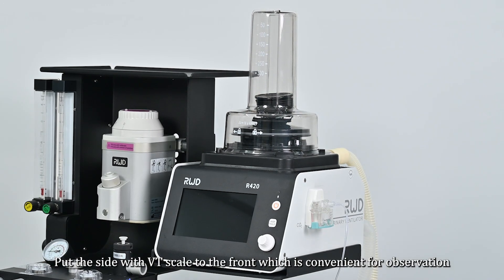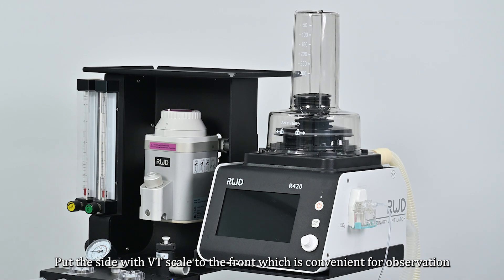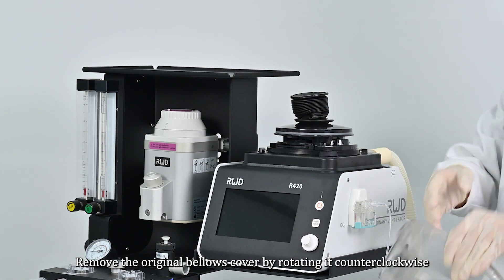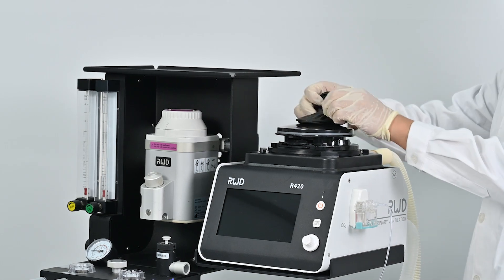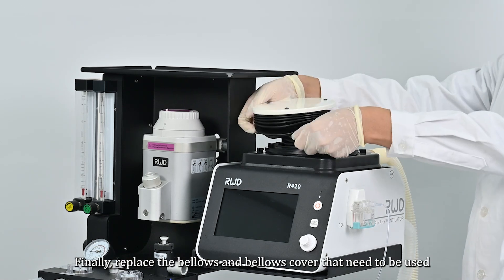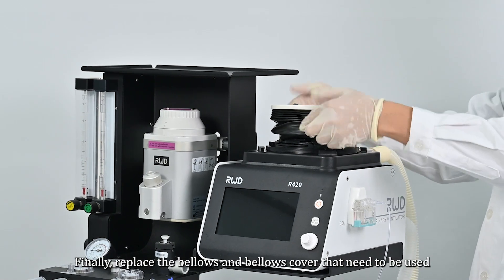Put the side with the VT scale to the front, which is convenient for observation. To replace the bellows, remove the original bellows cover by rotating it counterclockwise, then pull out the folding pouch directly. Finally, replace the bellows and bellows cover as needed.